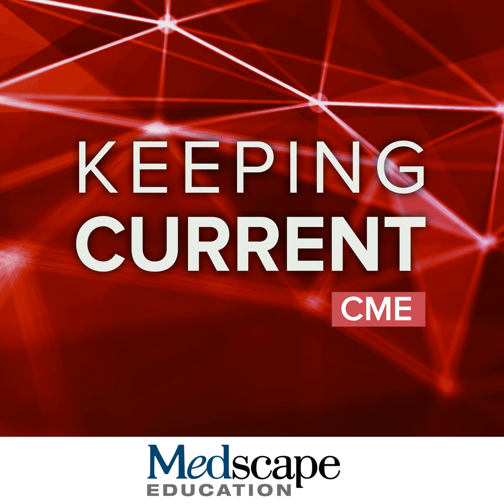And finally, when there's a patient on amyloid targeting therapy presenting with new neurologic symptoms, this is the one scenario in which gadolinium contrast may be warranted depending on the patient's presentation. Next, we'll move on to reporting of relevant imaging findings.